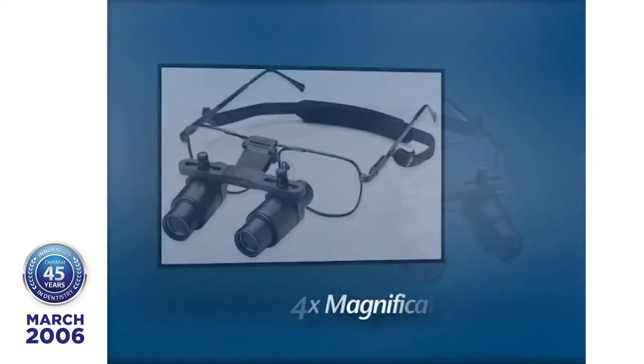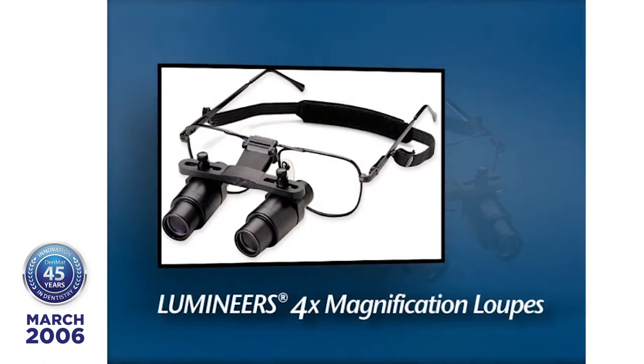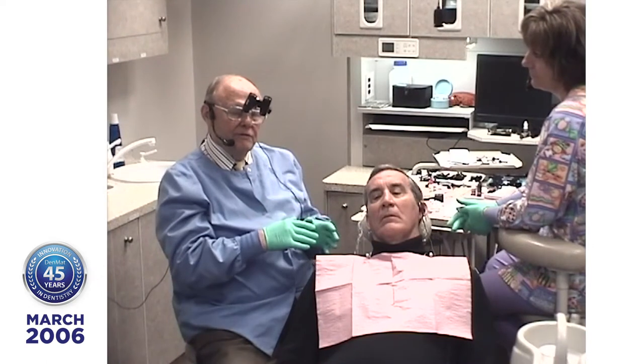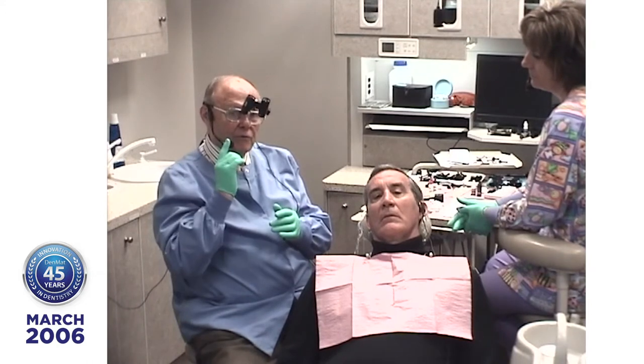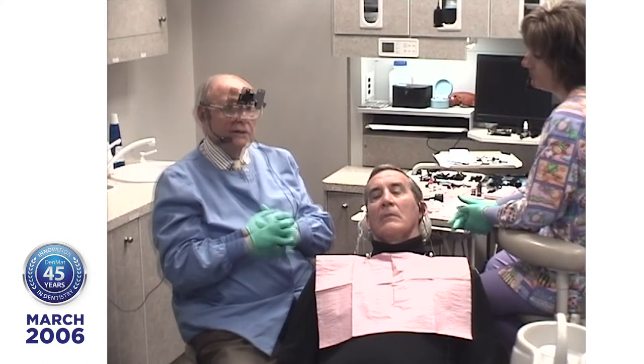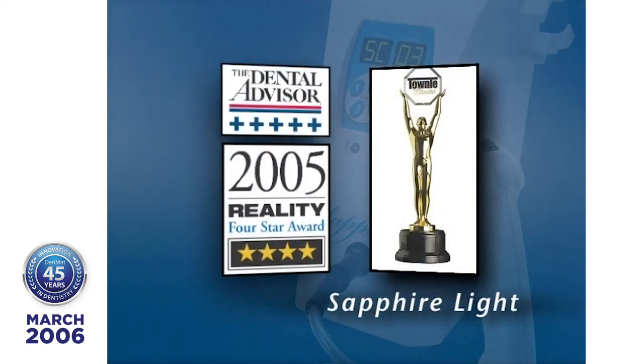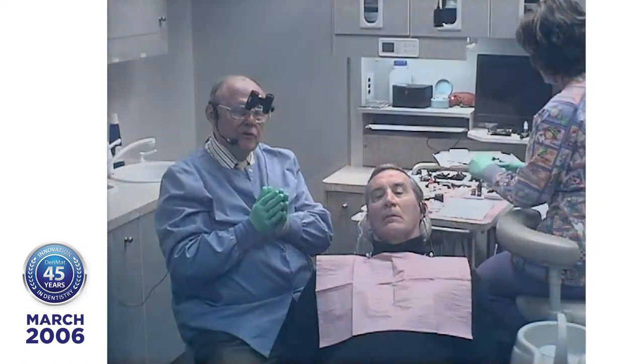So let's get started with a few of the tips that we have here. One is that I'm using 4-power magnification, not 2. 4-power magnification will enable you to work faster, do better dentistry, and when you see me doing the finishing and get right in those interproximal areas, I couldn't do it as precisely and as easily as I can when I have 4-power. Not 2.5-power. The other thing that's going to be very important is the pack light. And usually if you want to have controversy in your office, you put one in and then everybody fights to use it.